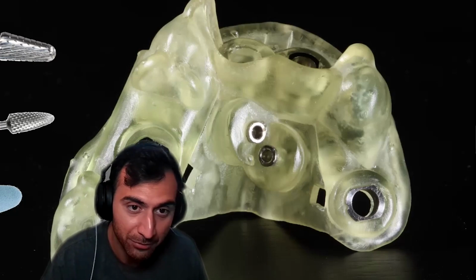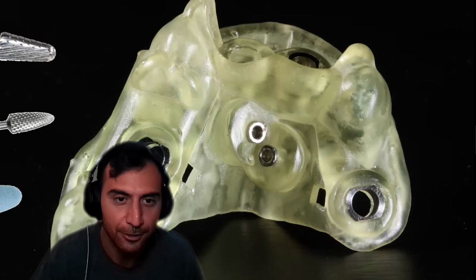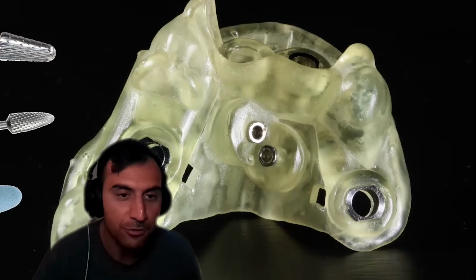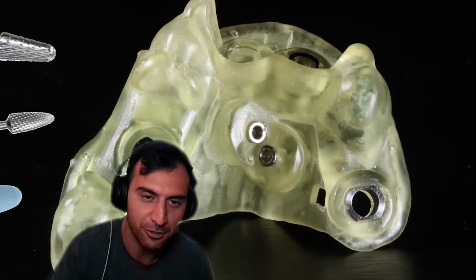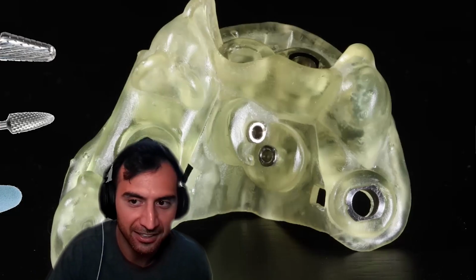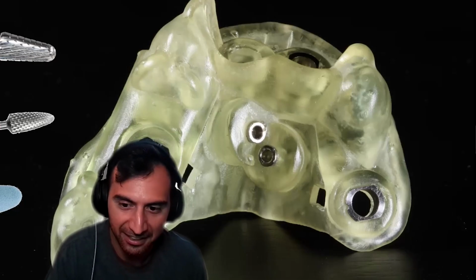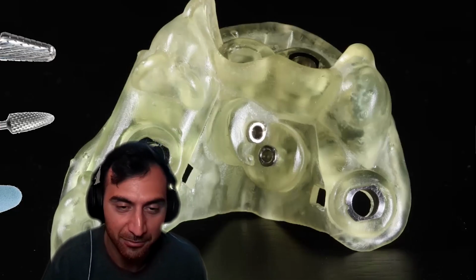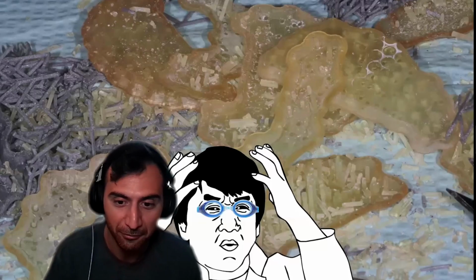I will tell you, labs that use printers do a lot of this afterwards so that when it gets into your hand, it looks awesome. You can tell by a lecturer who's sending out for it versus who's doing it themselves. Because when I see a lecturer show the most polished guide in the world, they're sending out to a lab to do it. When I see a guide that has a bunch of sticks still left on it, that's a doctor who's printing the guides himself. Guess what? They work exactly the same, sometimes even better in the hands of someone doing it themselves.